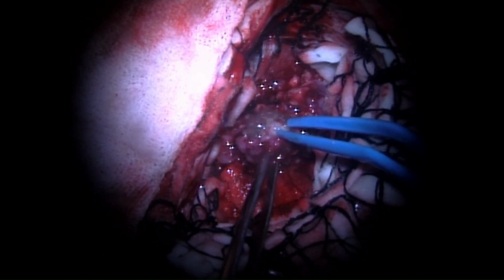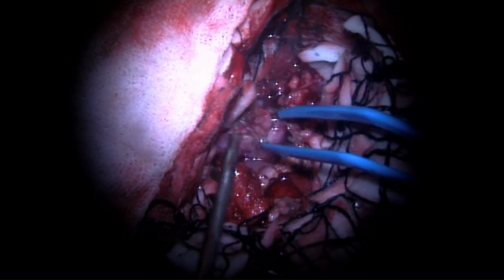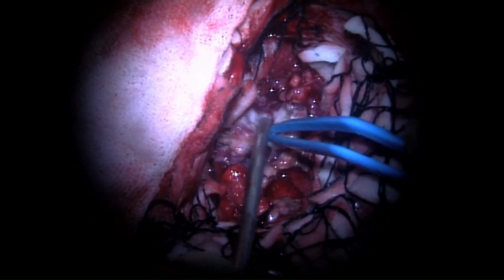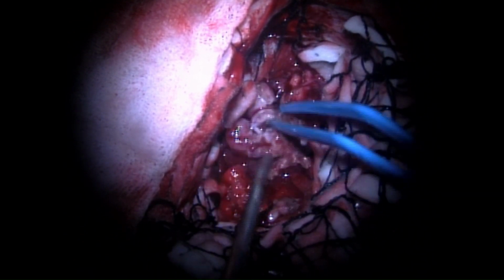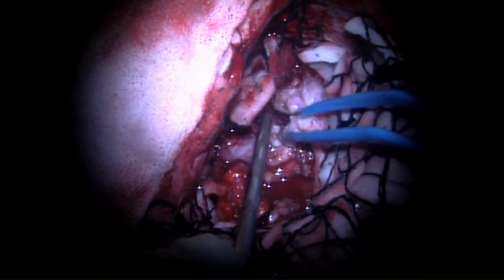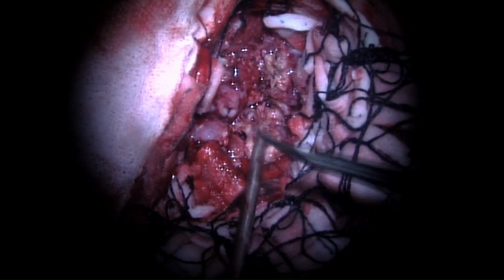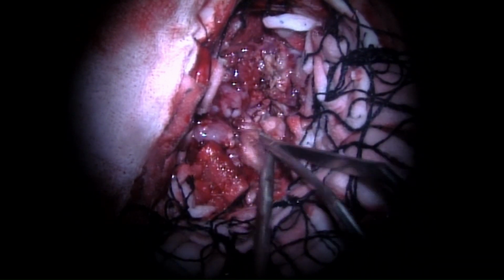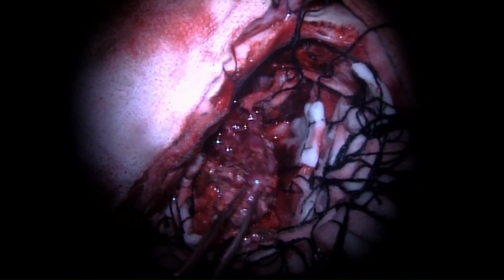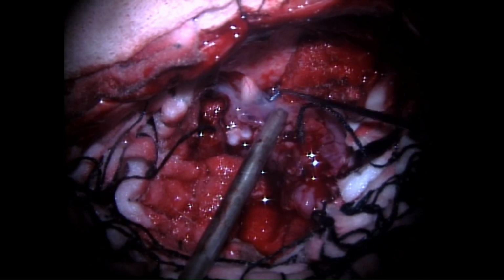And using the familiar sequence of bipolar coagulation and following it up with scissors to remove this tumor, and sometimes using my bipolar as a scissor, coagulating and cutting the tumor. Parts of the tumor were vascular as well.